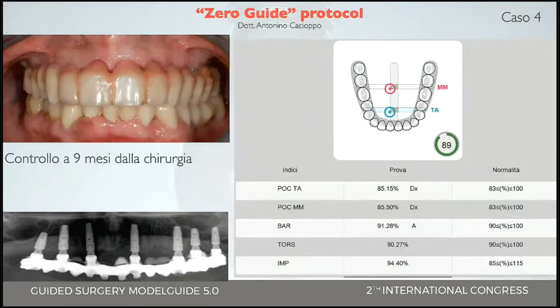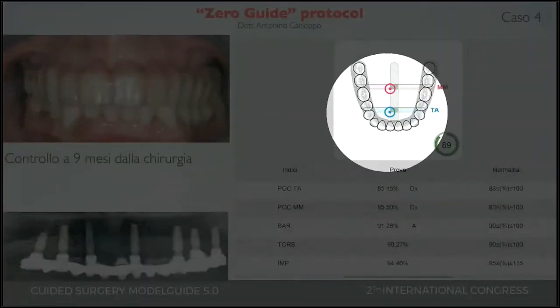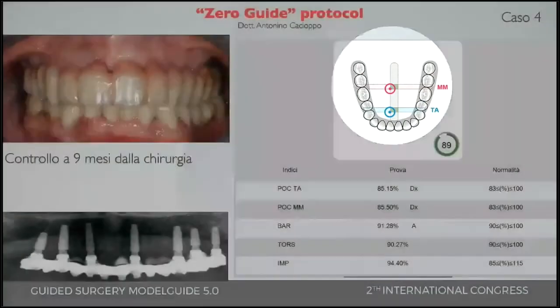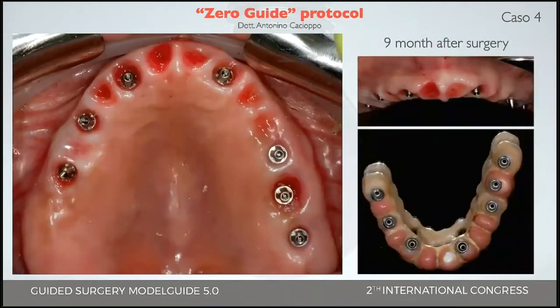And okay, the point is that the Teethan is a very good weapon to manage the occlusal point, the balance and the vertical dimension from time zero to the finish, or like in this case, to the time where we are ready for the final restorations.